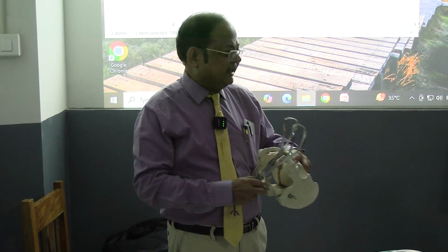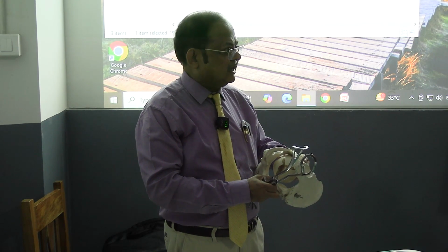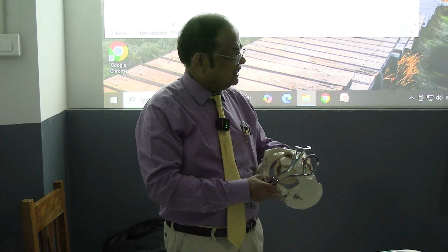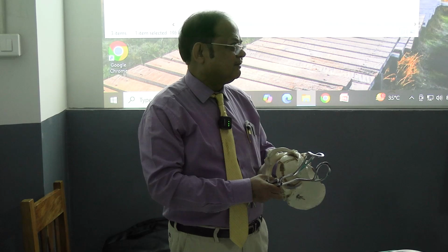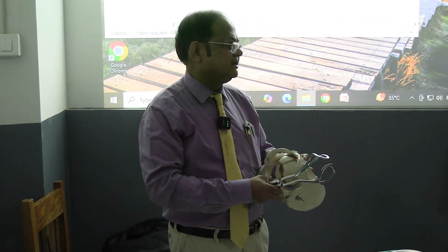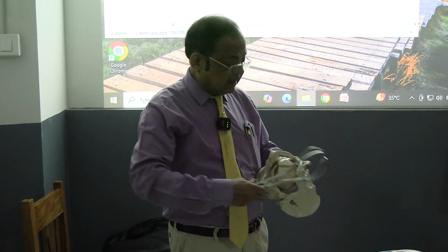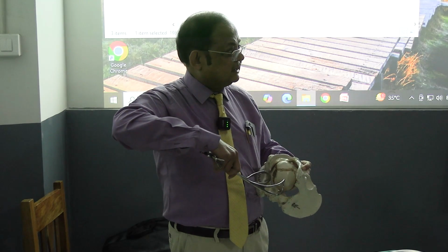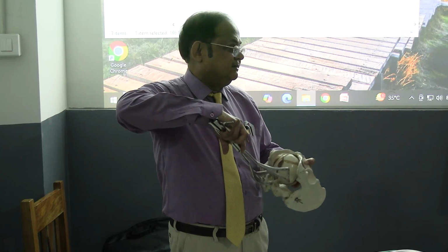But suppose the head is not rotated, what will you do? Either you rotate the fetal head manually and then apply the cephalic application, which is also the pelvic application, or you apply along the cephalic curvature, that is the cephalic application, and rotate with the blade.